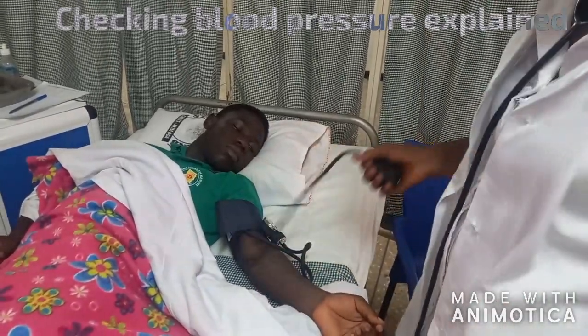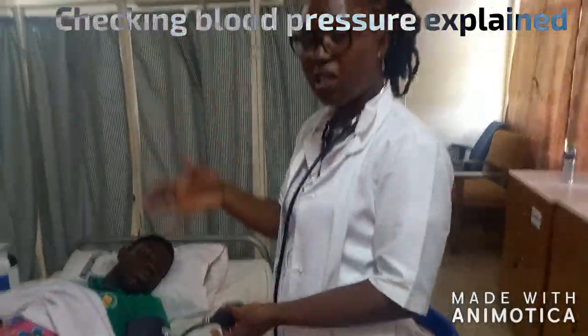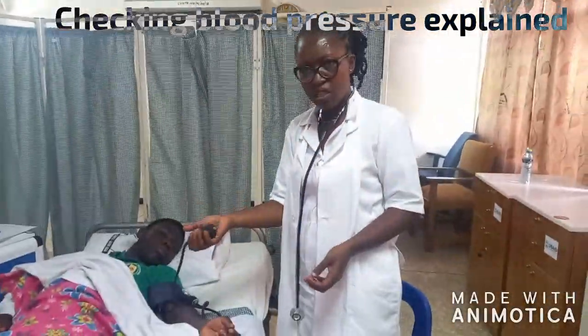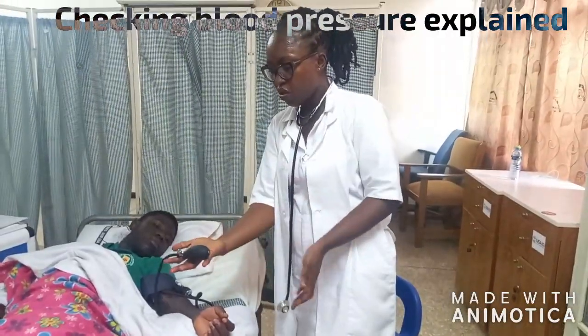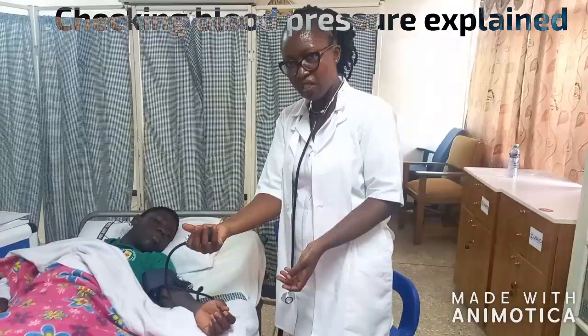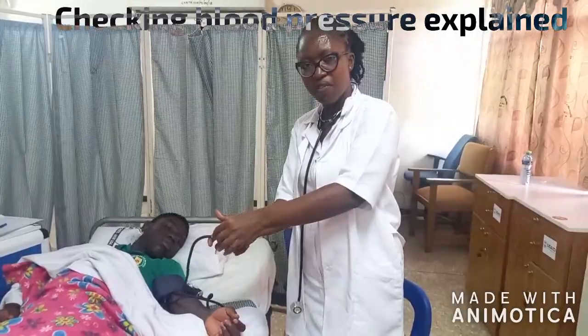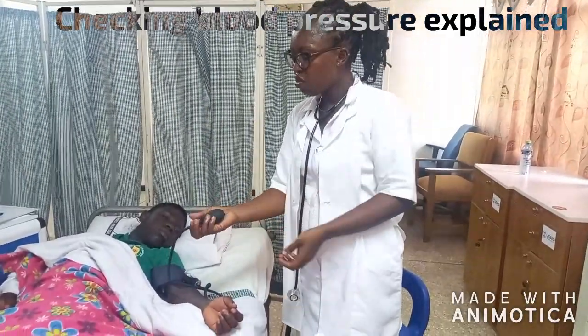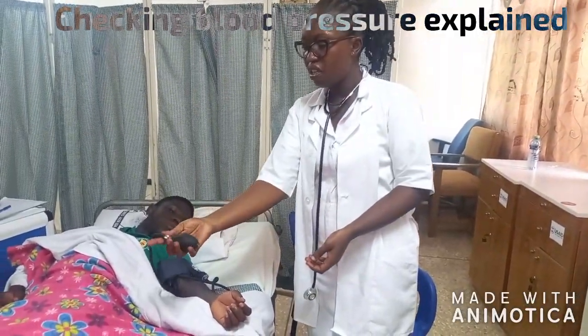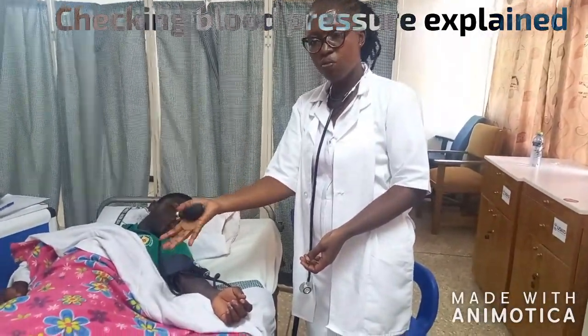With one hand, you hold the bulb of the pump in your palm, because you are going to inflate and we want to have control of it. We use only one hand to control it. You can't use the other hand to come and open the valve — this is the valve. So we use these two fingers to control the valve, and we use the palm here to pump.